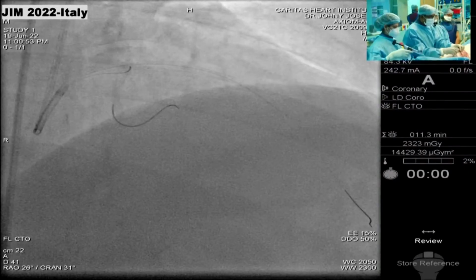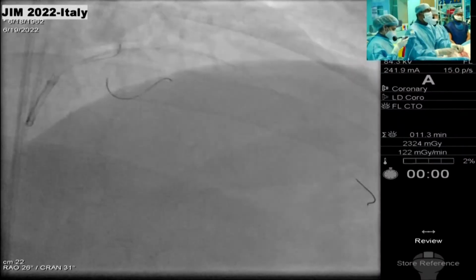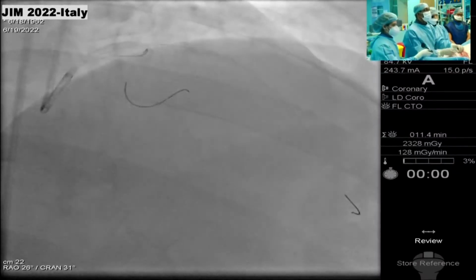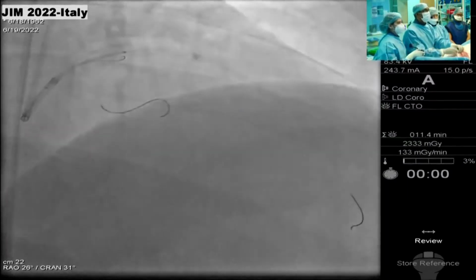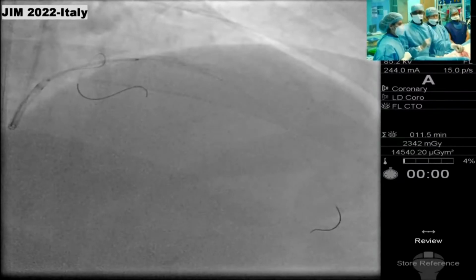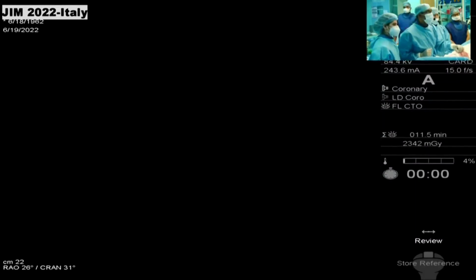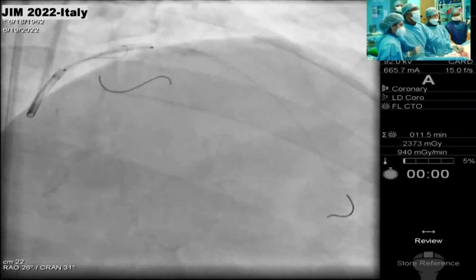3.5 into 28. While you're doing all that, can someone, perhaps any of the OCT experts there, give us the lengths from diagonal 1 to ostial LAD and from diagonal 2 to ostial LAD, because that's another feature OCT gives us in this precision thing, to help us understand precisely the lengths. So what kind of lengths did you get from those measurements of the OCT?